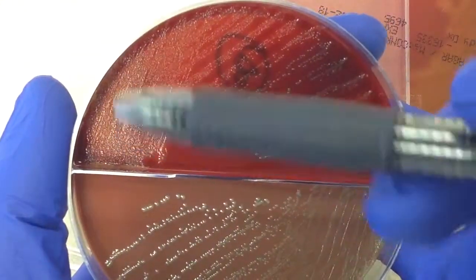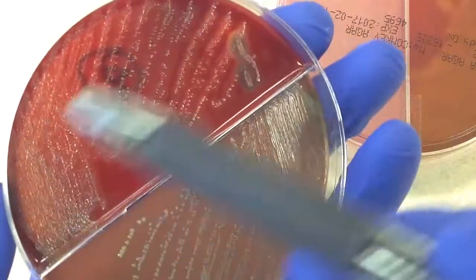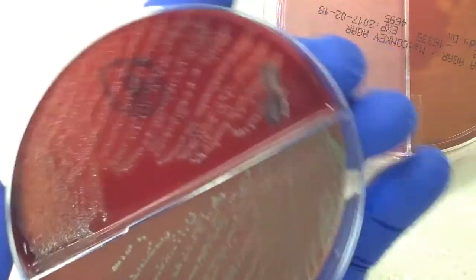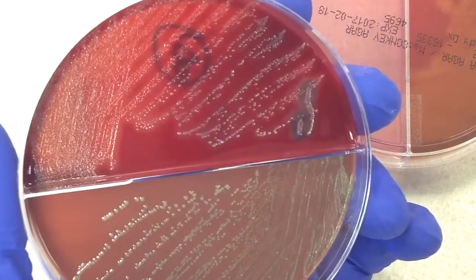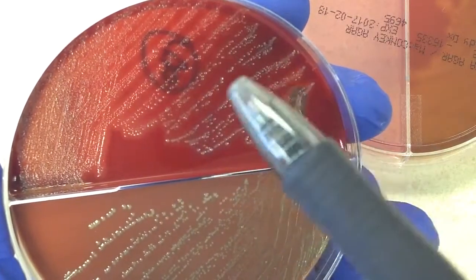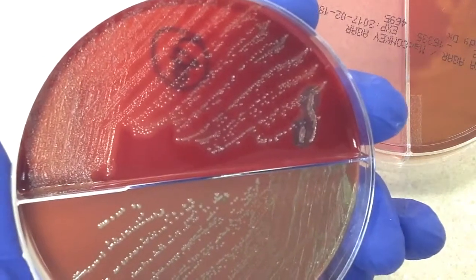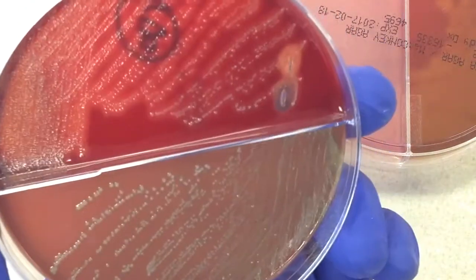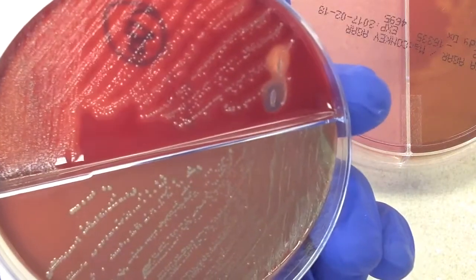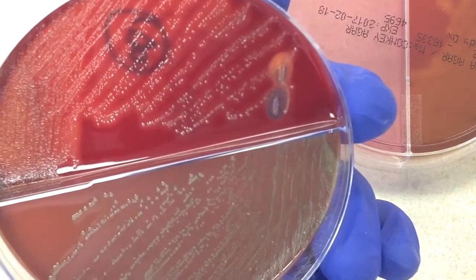So on these bi-plates, when we're judging how much of something there is, if it were just here, it would be rare, few, moderate, and then many. Now in the video, it's kind of hard for you to see all the little details, but I can definitely see some normal flora coming in here. So I'm going to say moderate normal genital or vaginal flora, many beta hemolytic colonies, identification and susceptibility testing to follow.